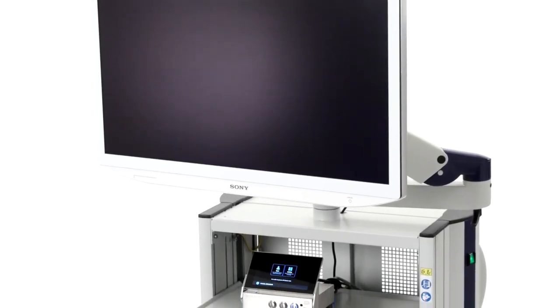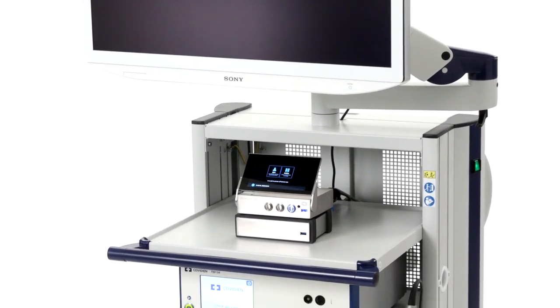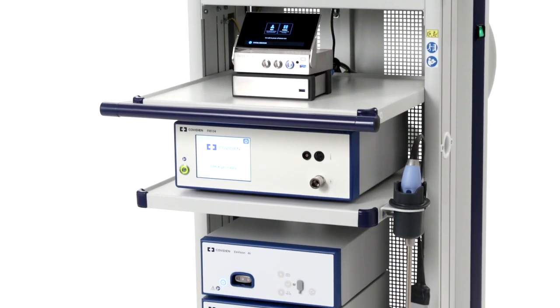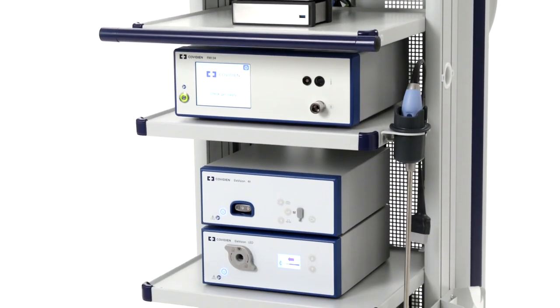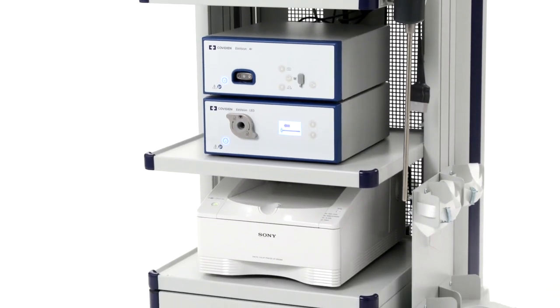Clear vision makes all the difference. Choosing the right visualization system for your OR is an important decision. Explore how the Elevision 4K Plus platform can help provide a complete laparoscopic solution for your MIS procedures.